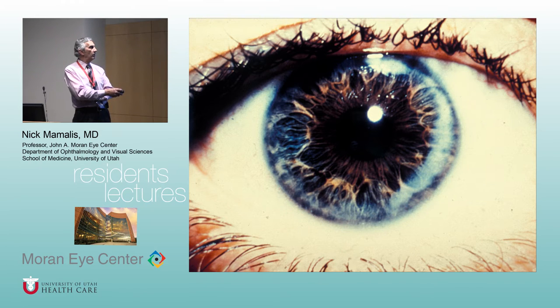But if you look right here, it's interesting when you see this arc of this shadowing around the periphery. Note the clear zone. And so whenever you see a clear zone and then the limbus here in a clear zone, it usually means that this is kind of a diffusion gradient of some kind, or people have speculated that this may be diffusion.